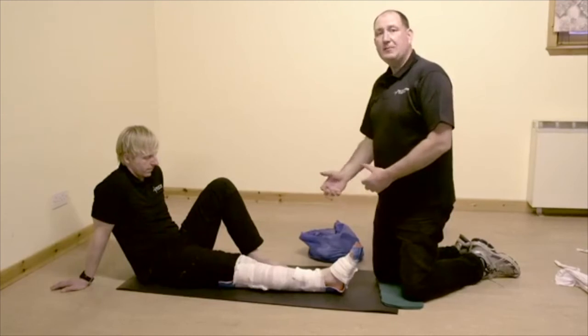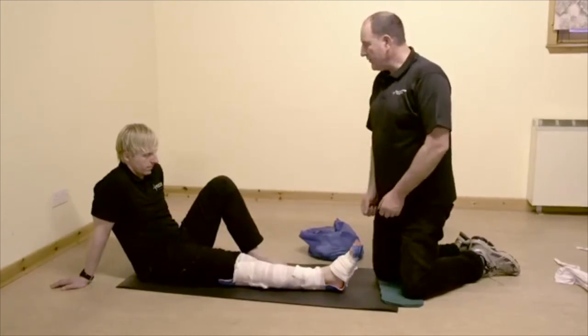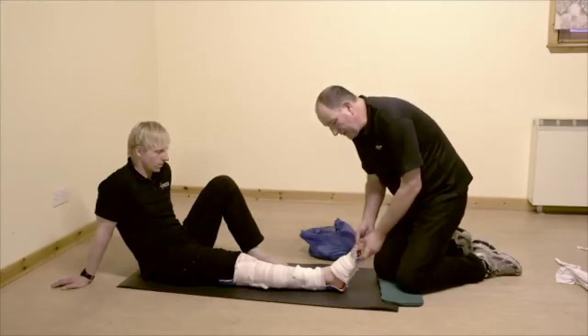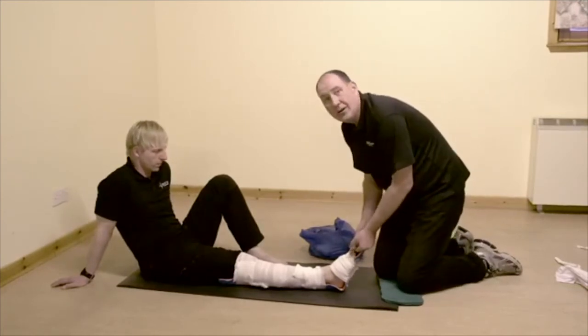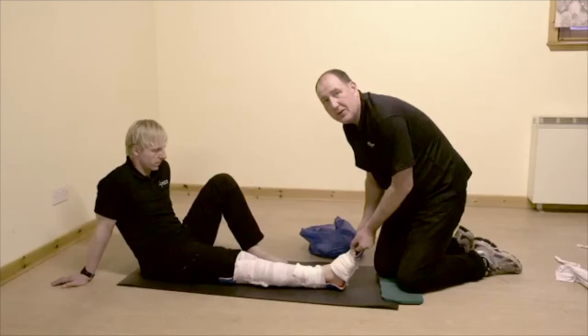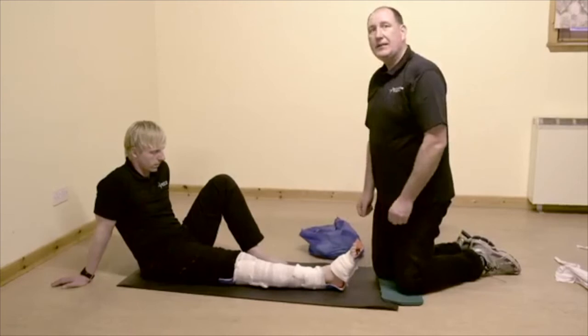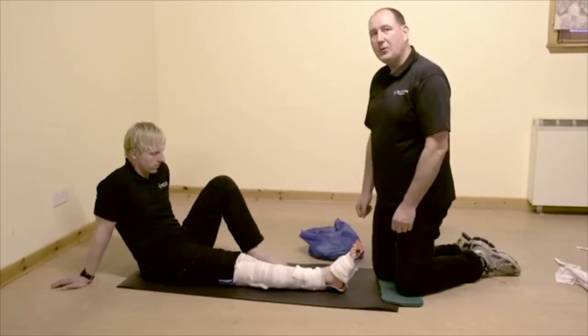We could use lots of different things for this bandaging - but how does it feel, Tom? Does it feel stable? Feels really solid, comfortable. We've left his toes exposed so we can just check for colour at the end of his toes to make sure his circulation is still good. And in the real world, in the outdoors, we'd want to cover this up now to keep him warm while waiting for help to arrive.